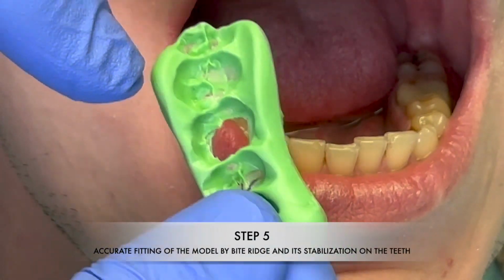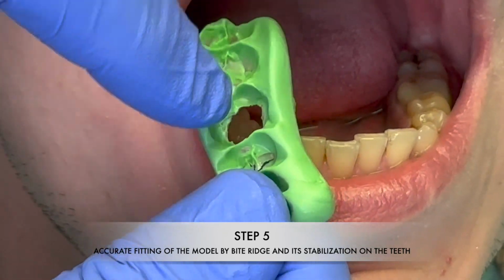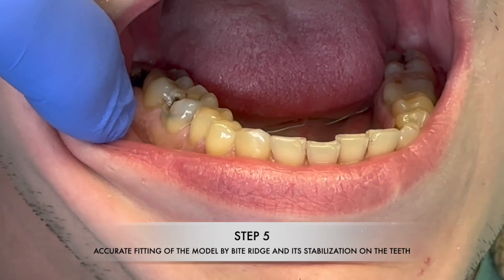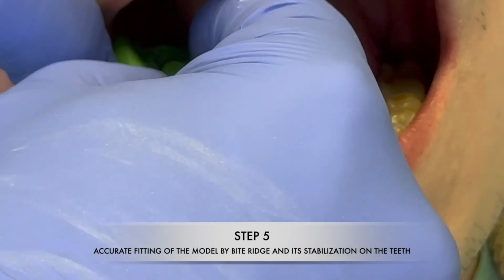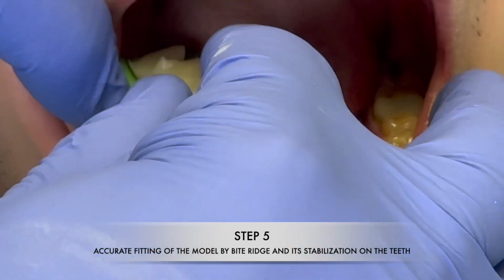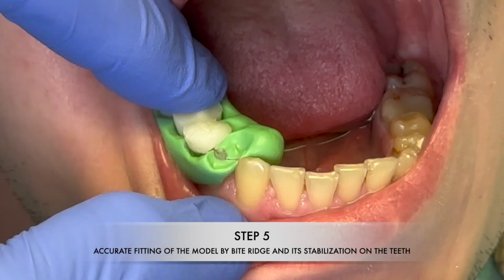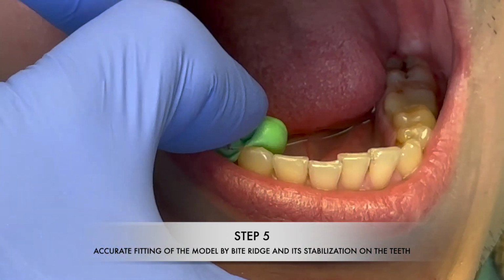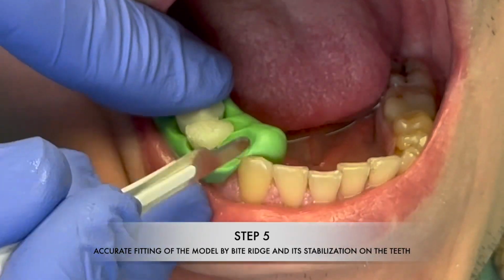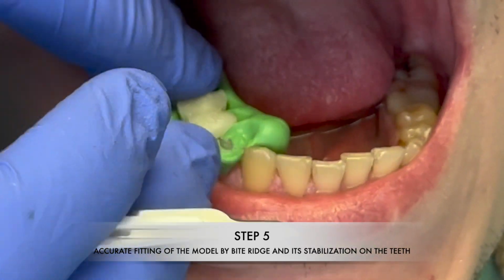Step 5. Precise positioning of the plastic model on the teeth of the lower jaw using the bite ridge. Without a bite ridge, the model may move slightly or create an incorrect lean to one side or the other. During the restoration, when constructing the morphology of the chewing surface, we will be guided by the model. So, it is very important to create a stable and uniform position of the model on the lower teeth.